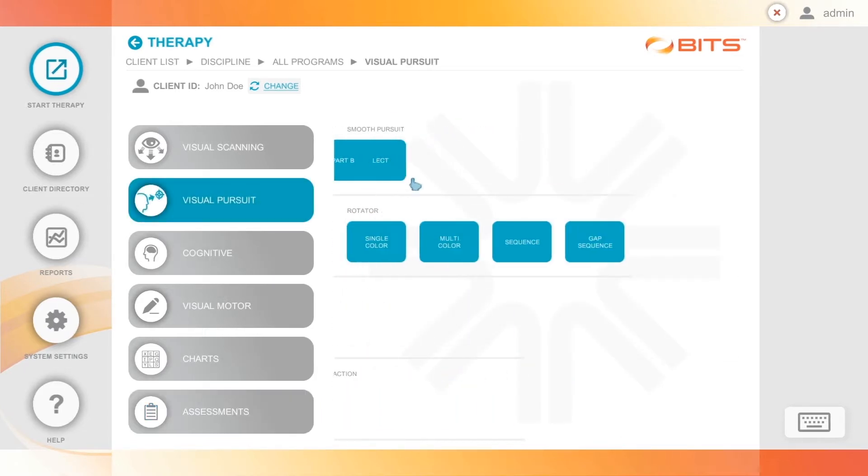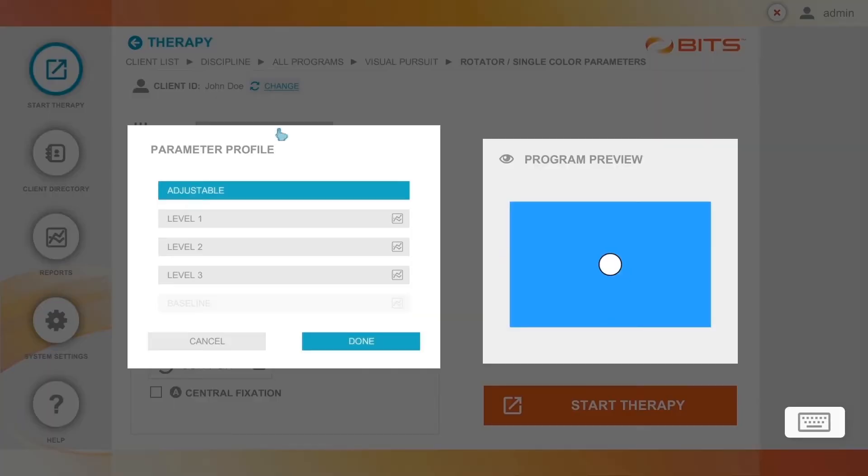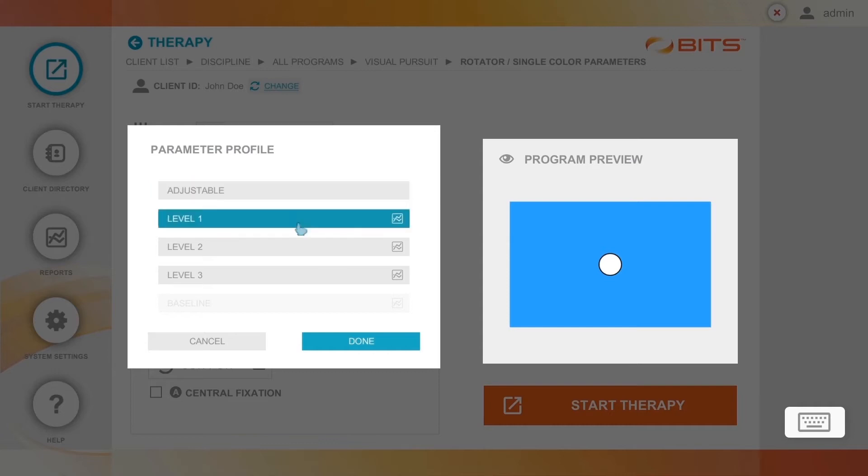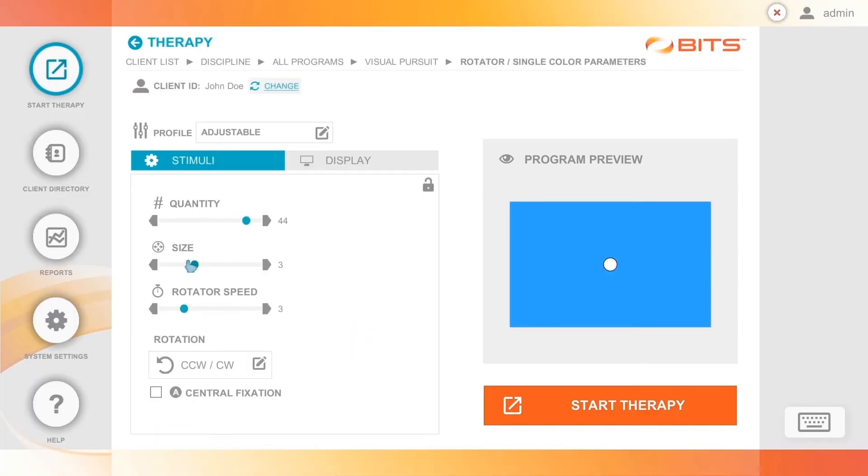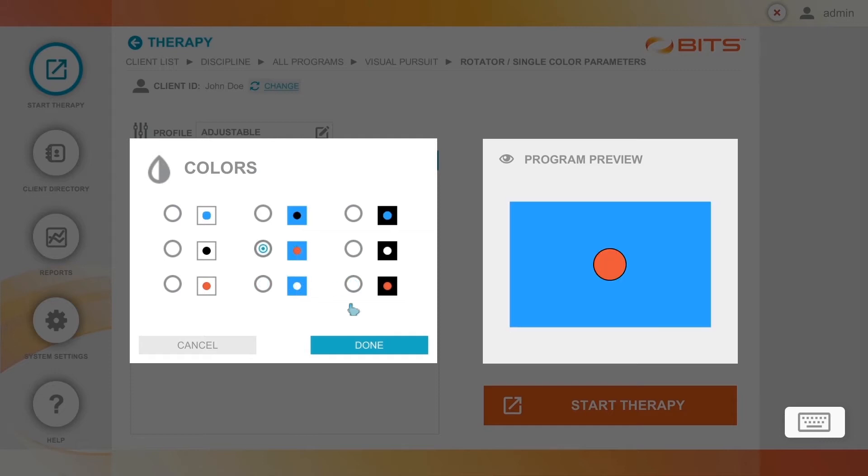Jump right in with preset parameters, or fine-tune the level of challenges using any number of customizable options. You can even upload your own photos and text.